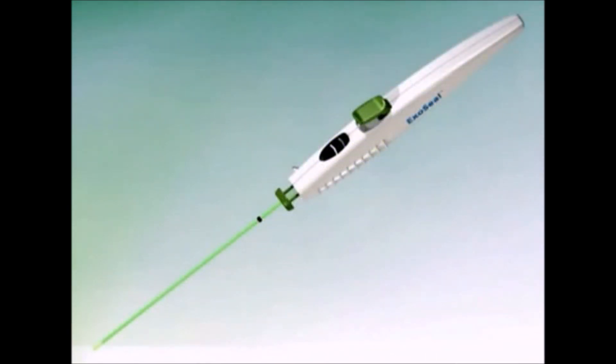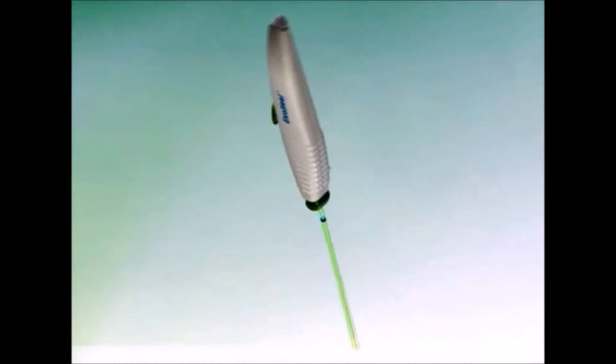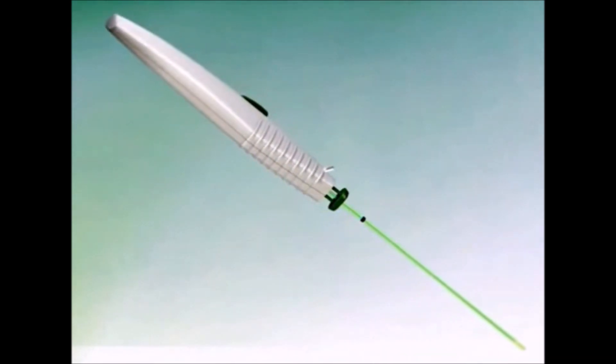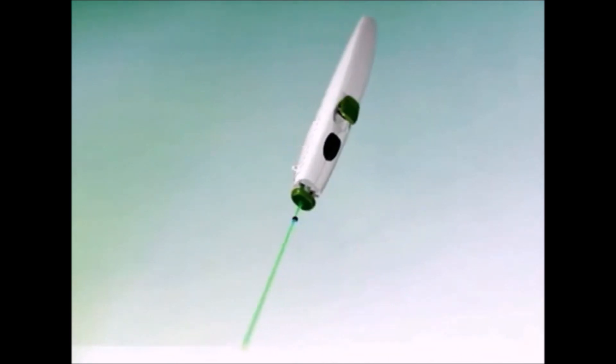It's recommended for femoral artery puncture site closure, reducing time to hemostasis and ambulation in patients who have undergone diagnostic or interventional procedures using any standard 5, 6, or 7 French femoral introducer sheath with up to 12 centimeters working length.